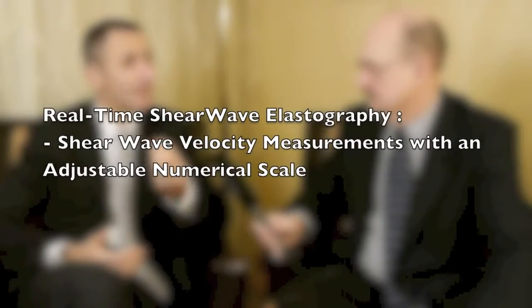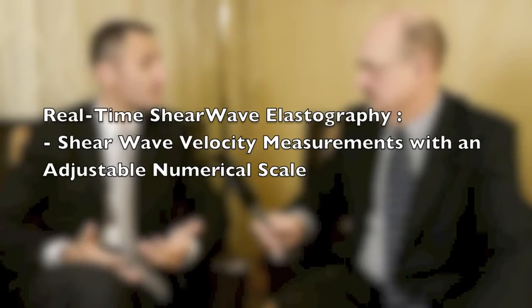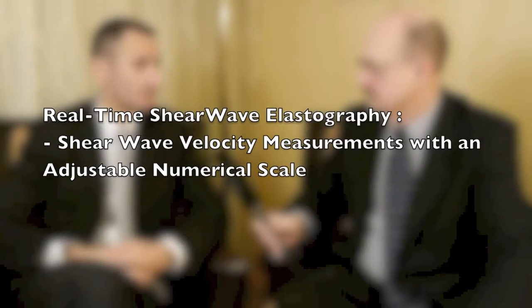So that's very similar to a dynamic range adjustment in other areas in ordinary imaging. That is exactly the same adjustable dynamic range like in every other imaging modality. In B mode, you may want to adjust your dynamic range. In color Doppler, you may want to adjust your dynamic range depending on the speed of blood flow that you measure. Now in ShearWave, you get again that same capability of being able to adjust the dynamic range to see the exact optimal stiffness variation that you want to depict on tissue. That's a very interesting development.